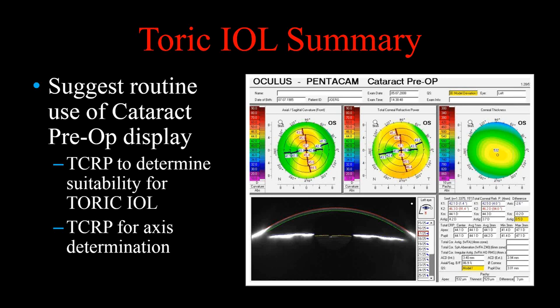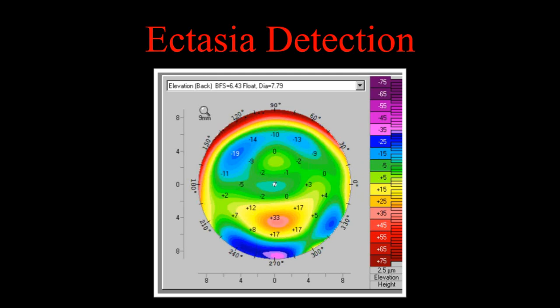With that, I think we're going to change subject into the things I more commonly talk about. We're going to start off with a little bit about ectasia detection. I'm kind of doing things in reverse order, because many of you have heard me just talk about keratoconus, et cetera, so I think we move some of that towards the end.